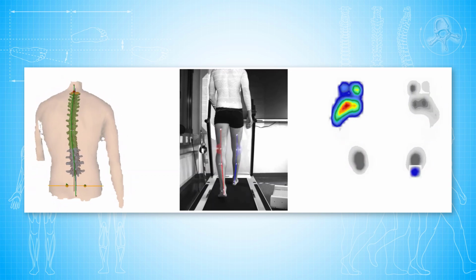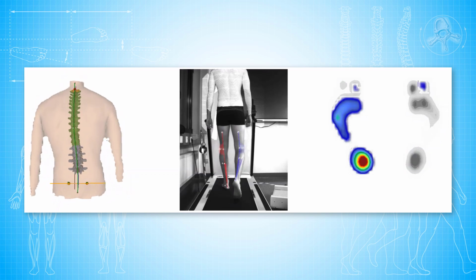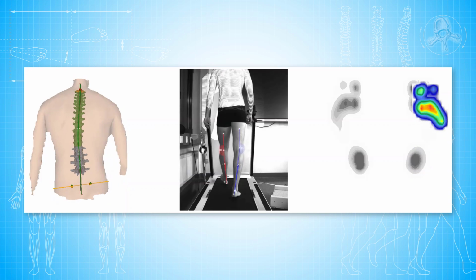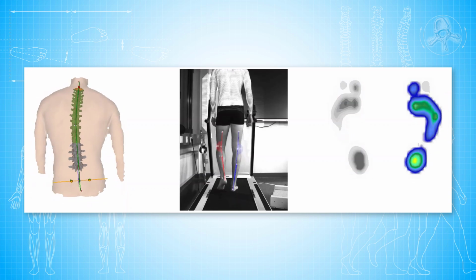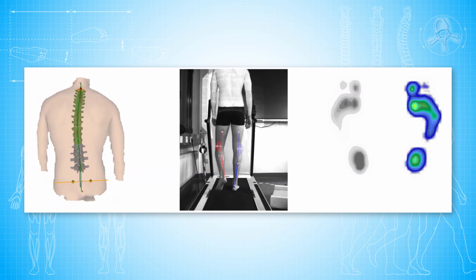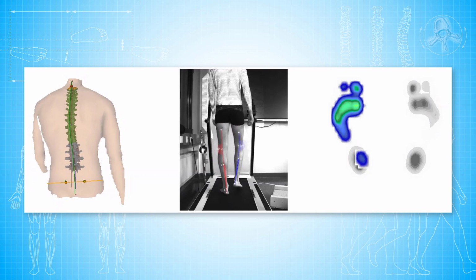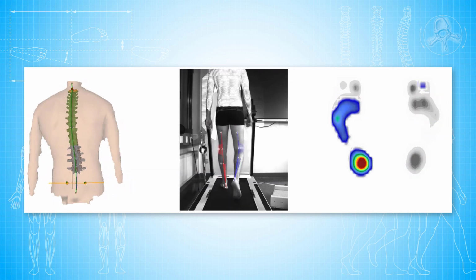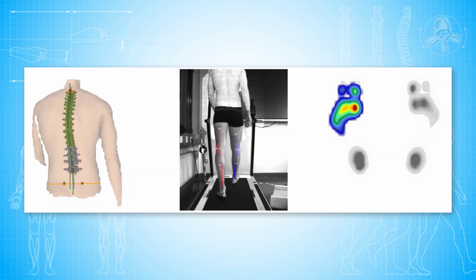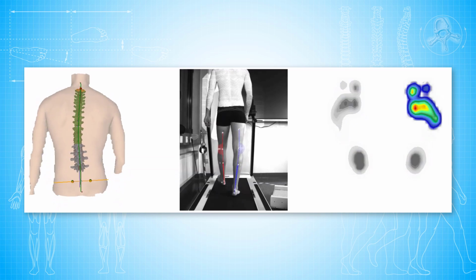Observe your patient walking on solid ground. You also want to be able to observe this kind of gait pattern in the treadmill situation. Let the patient put his fingertips on the handrail to get used to it. This creates spatial orientation and initial stability. Inform the patient if the steps are too short and ask him or her to take longer steps. This usually leads to an approximate neutralization of the step length.